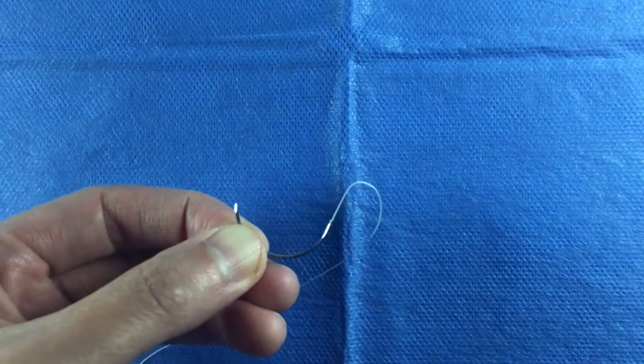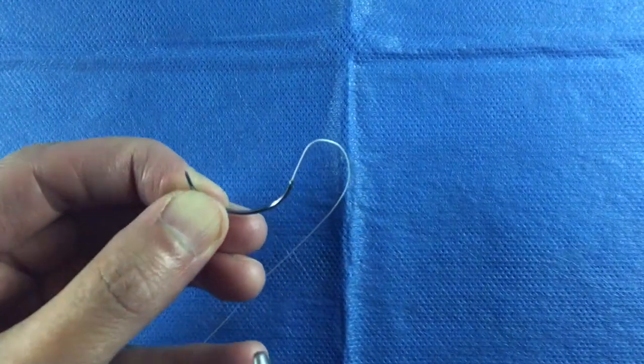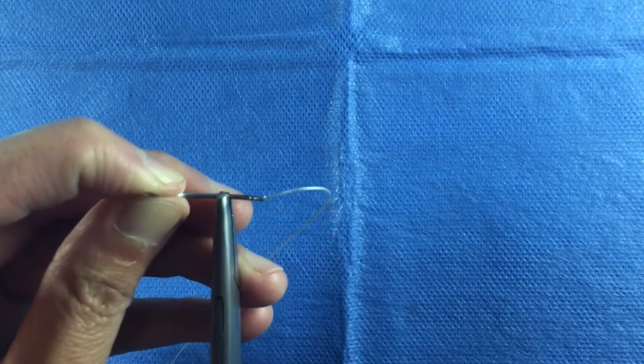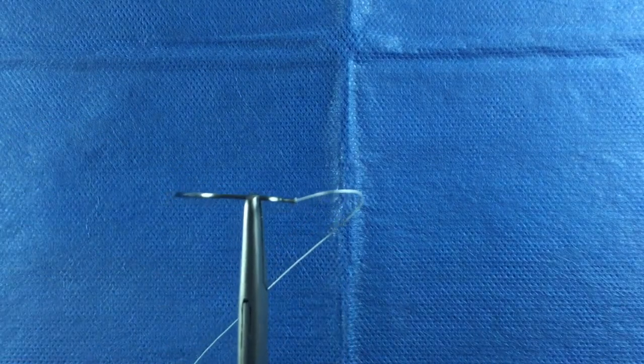To properly load a needle on the needle driver, grasp the needle two-thirds along the curve from the tip of the needle and one-third from where the suture is swaged to the needle.